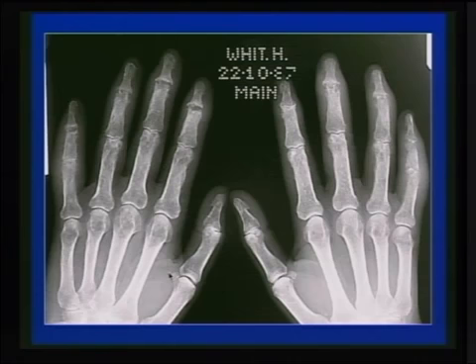For this case, the alignment is maintained, the bone density is slightly reduced, especially around the joints, and the joints are pseudo-widened. They are not really widened too much, but they are distracted. That's why they look wider than the usual adjacent joints, which are normal. There is some soft tissue swelling and sausage-like digit involvement of the distal aspect. This is psoriatic arthropathy, a typical presentation of psoriatic arthritis.